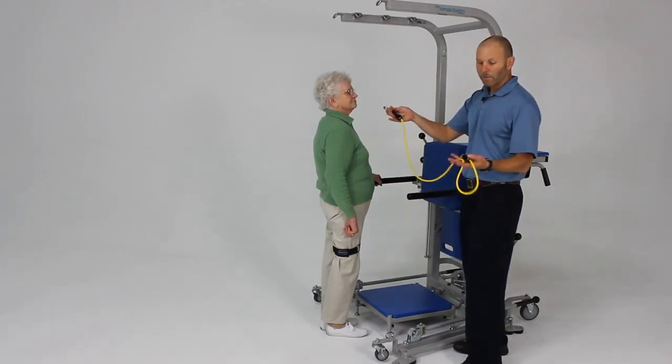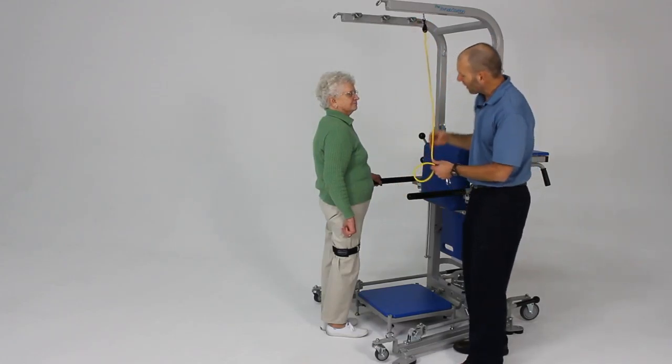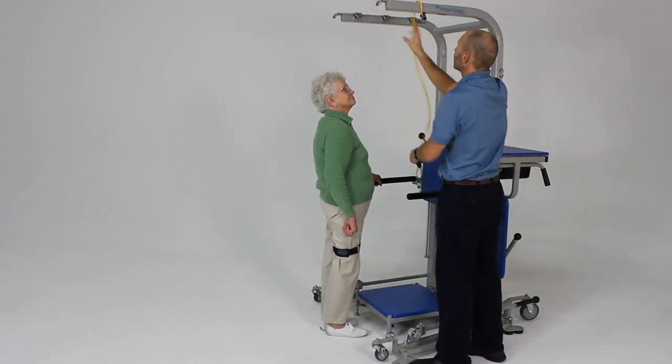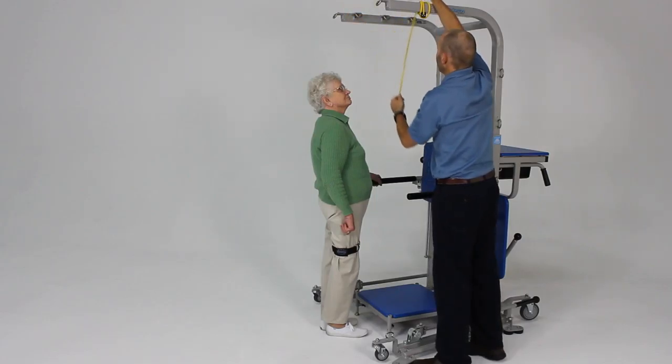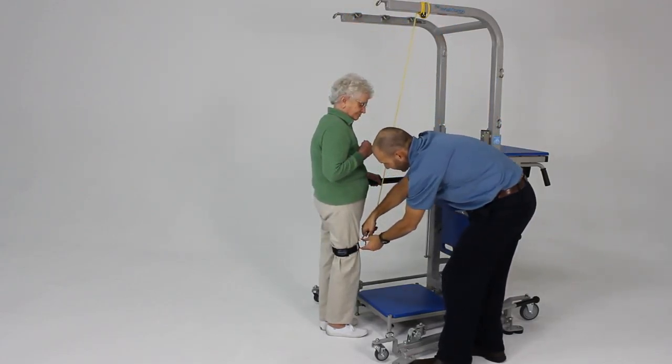What we can do is take one of our elastic cords again here. I'm going to clip it in so we have a slight angle down to the thigh here. I can adjust the length of this for support by just simply looping it up over the top of the unit a few times, to adjust the amount of stretch. I'm going to go ahead and clip this into the thigh strap here.